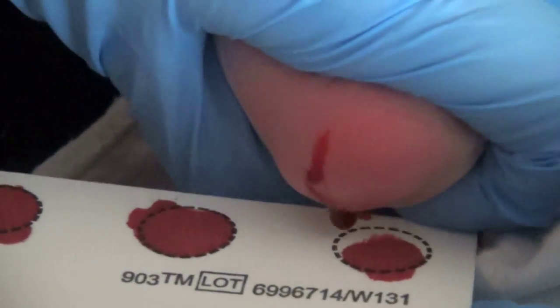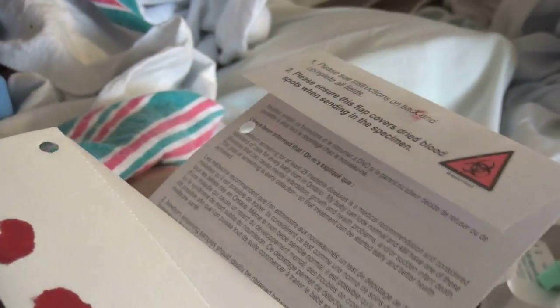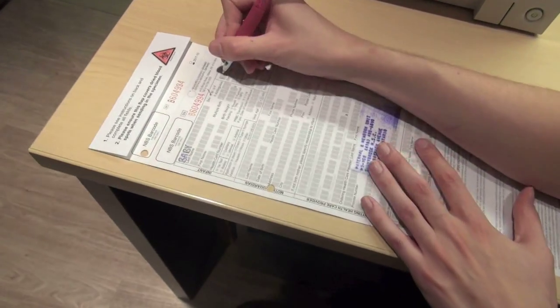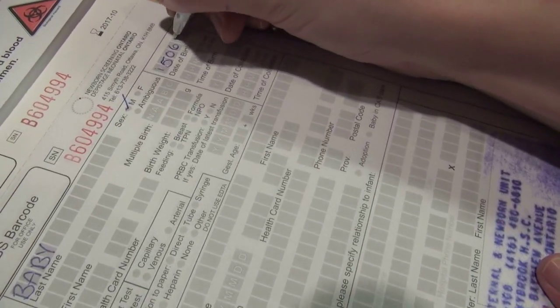View the reverse side of the collection card to ensure that there is complete saturation of the blood through to the back of the card. Include the date and time of birth and the date and time of collection.